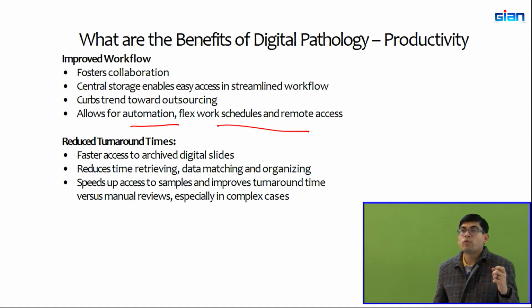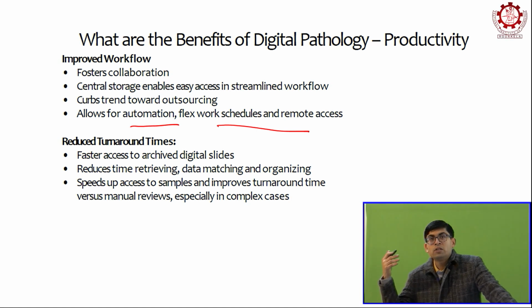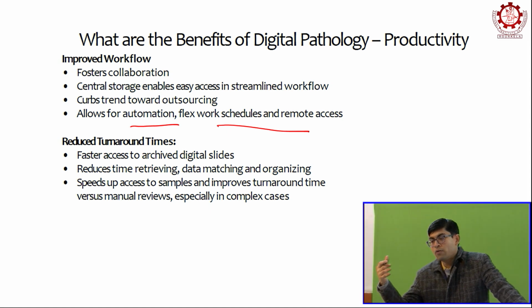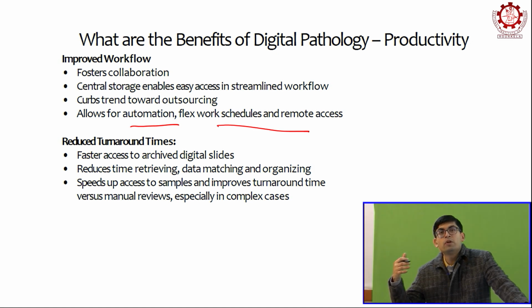So why is this important? Because pathologists every day have to look at hundreds of slides, right? Taking slides that are physically there, mounting them on the microscope, reading the slide, analyzing the slide, writing the reports, then putting it back, getting another slide. Yes, traditionally pathologists are used to that, but imagine if something like this can be done digitally, it would definitely improve the turnaround time.